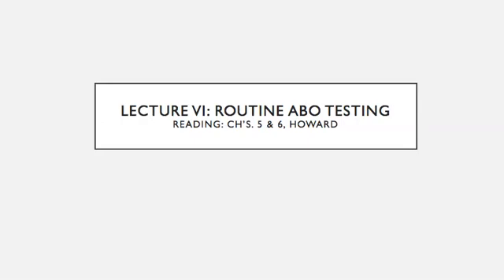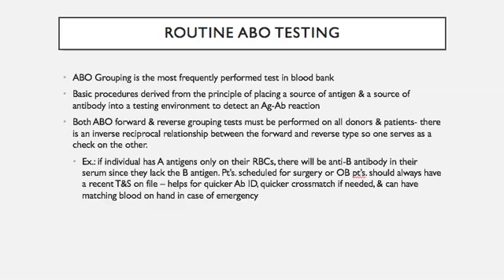In this last video for Unit 2, we're going to be talking about some of the routine ABO testing that we would perform in blood bank. So the ABO grouping is the most frequently performed test in blood bank. That's just us determining the patient's blood type.